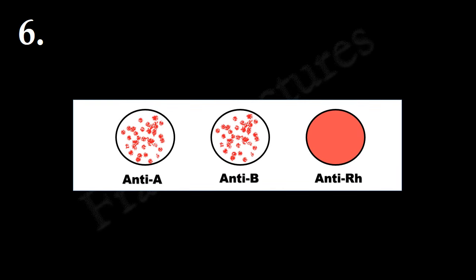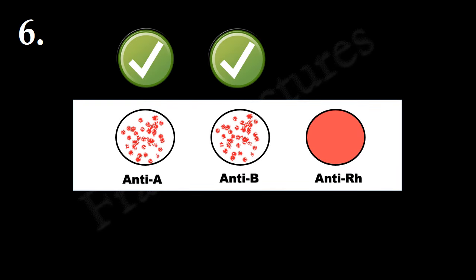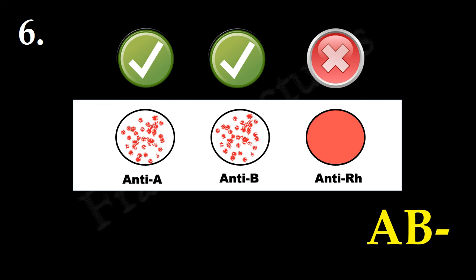Here, agglutination in the anti-A and anti-B circles indicates that both antigen A and B are present. But there is no agglutination in the anti-RH circle, which indicates the absence of RH antigen. Therefore, blood group is AB negative.